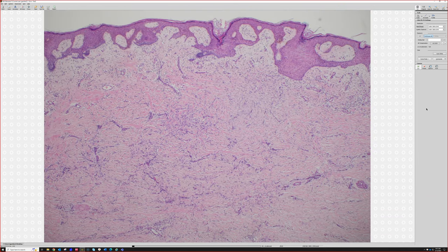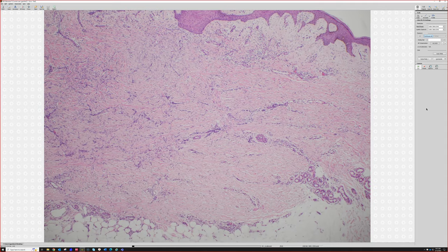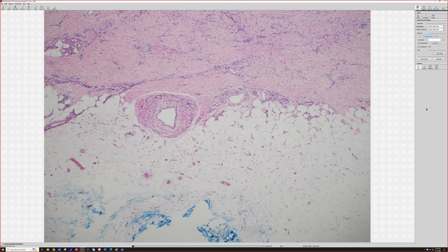That's why I don't go straight to the spindle cells. Look at the pattern from low power, particularly for dermatofibromas, because the least important thing is the cytology of the cells, usually. Most important thing is what the epidermis is doing, how it interfaces with the surrounding dermis, how it interfaces with the underlying fat. And usually there's not very much involvement of the fat, but some cases can trap fat a little bit or extend deeply into fat. There's weird exceptions outside the scope of what we're talking about today. So that's kind of a sclerotic example of dermatofibroma.